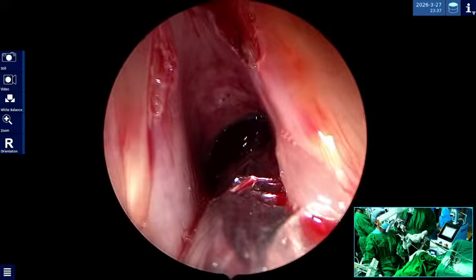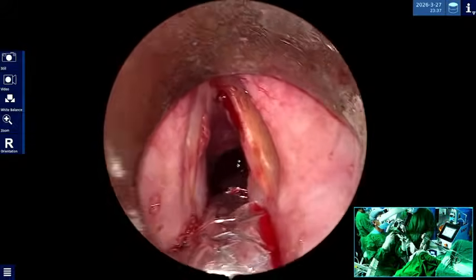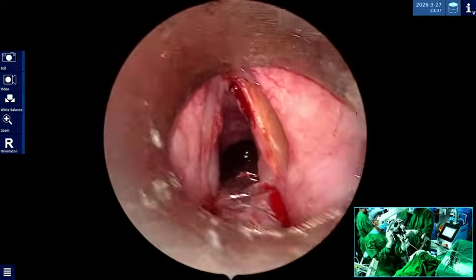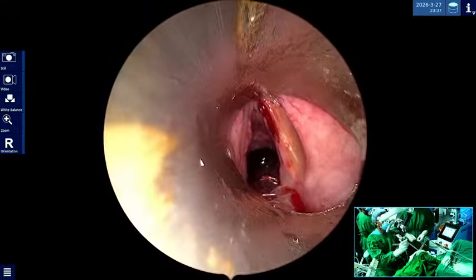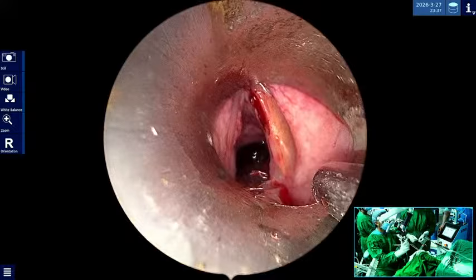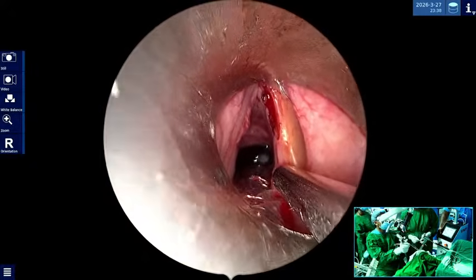So the tube is secured with methylene blue, you can see here, sir. Yes. And second thing is here the aluminium foil which they have used just above the cuff. So that will also protect the tube from fire hazard.